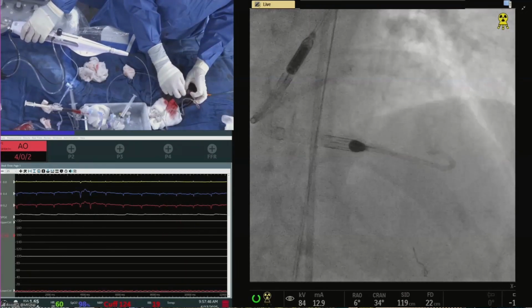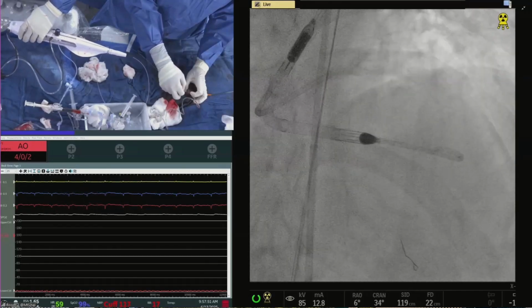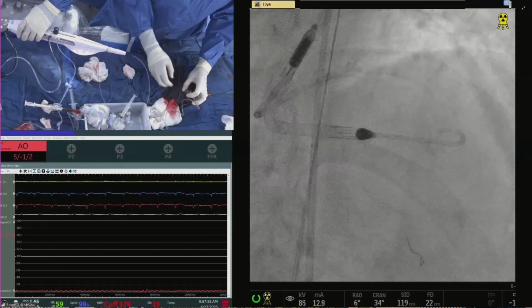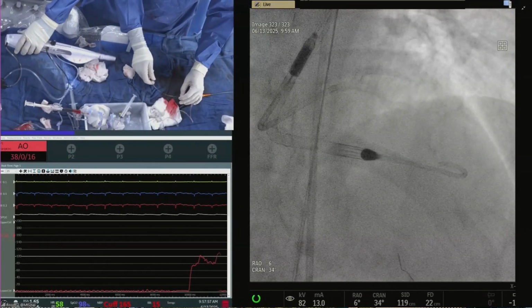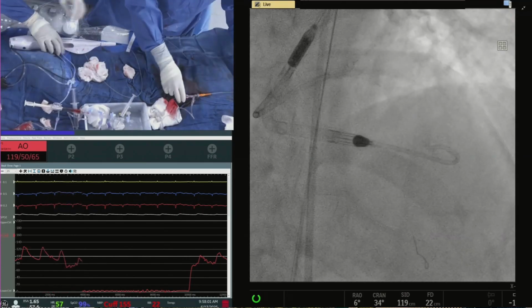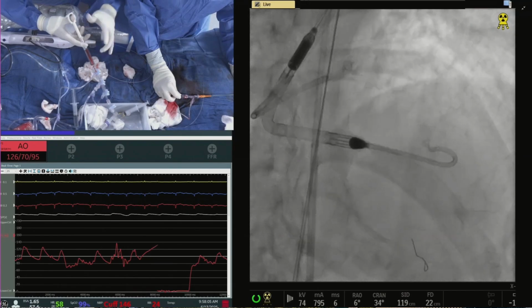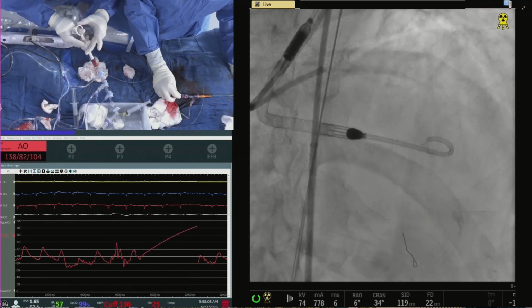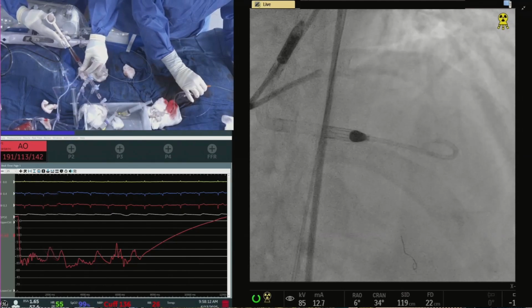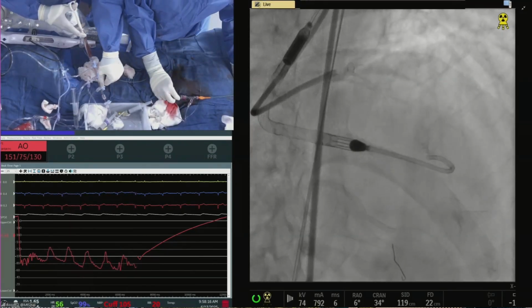So we did try dilating, you were there when you saw us dilating the LAD and diagonal, right? Mm-hmm. We're going to take a picture now. Yeah, it's done. Okay, take a minute, right? Yep. This is maybe why the guide... Okay, good. Your pressure's good.